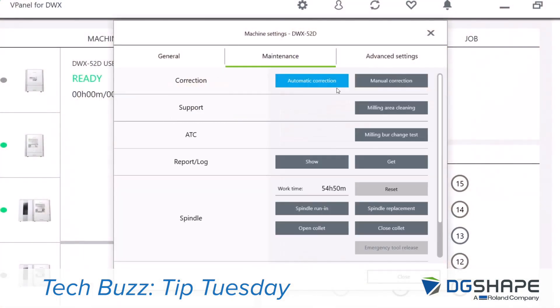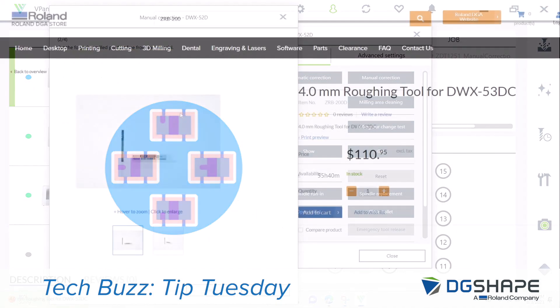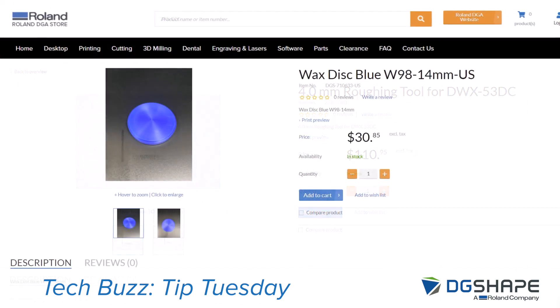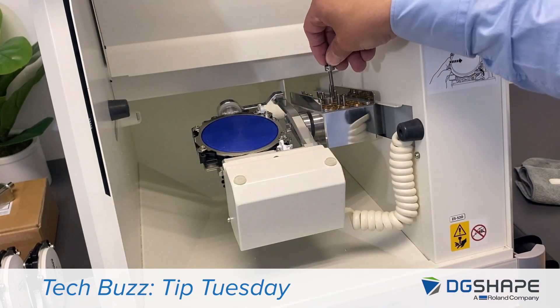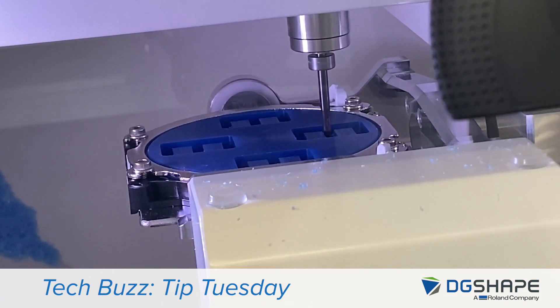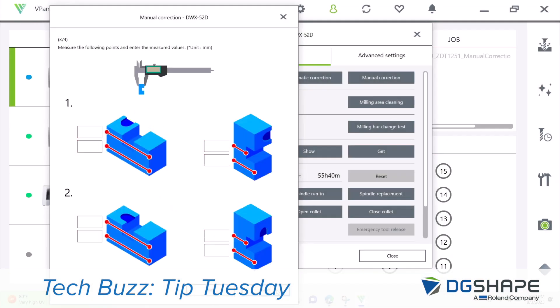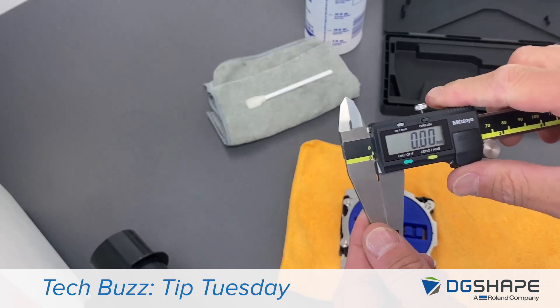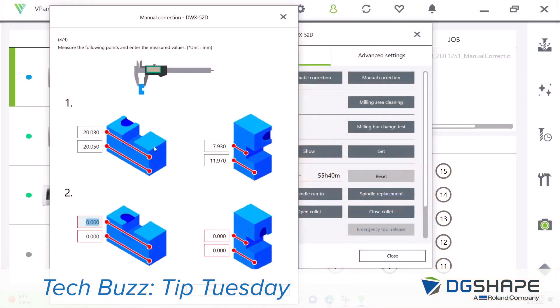And last, we'll perform a spindle run-in. From vPanel, select manual correction and follow the instructions. You can purchase the 4mm burr and the wax block from our online store. Set the 4mm burr into position 1 and the adapter with wax in the C-clamp. Send the job and four blocks will be milled. Remove the blocks from the disc. Using calipers, follow the instructions in vPanel, get the values, input them into the application, follow the steps, and you're completed.